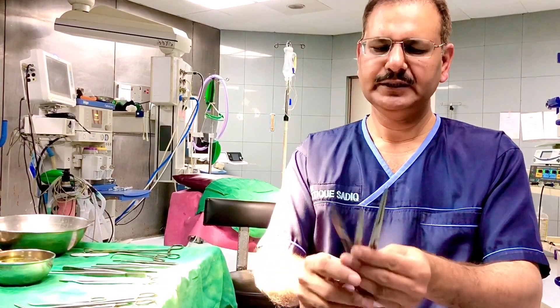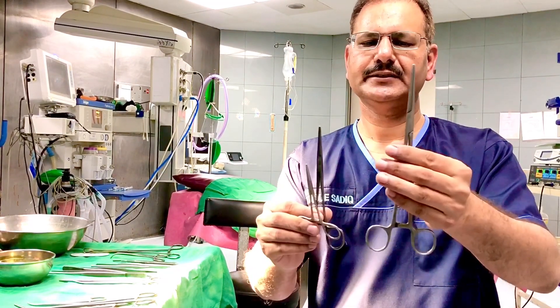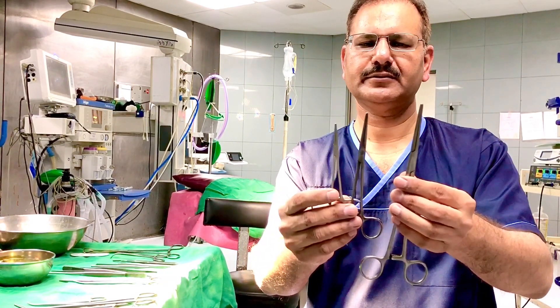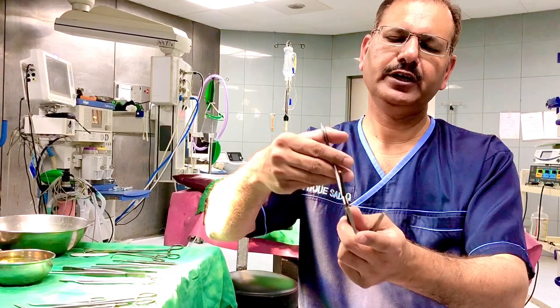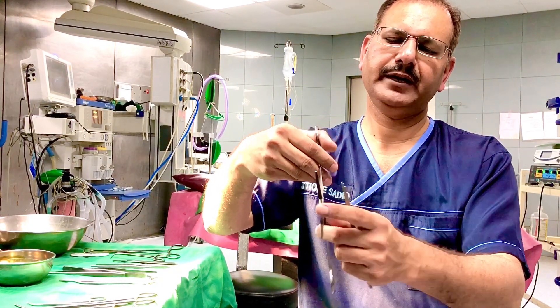Among grasping instruments, these are straight artery forceps in different sizes: large, medium, and small. Straight artery forceps do not have teeth in front of them, and their corrugations are parallel.